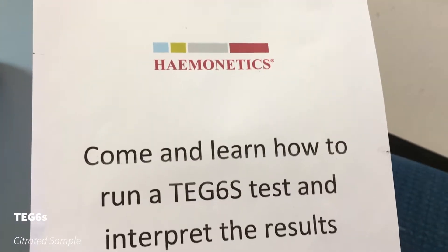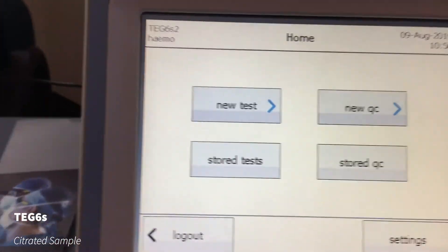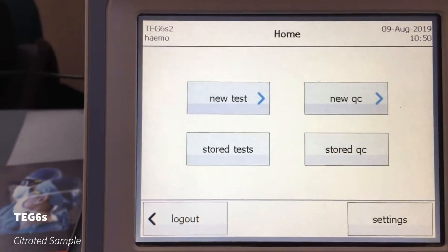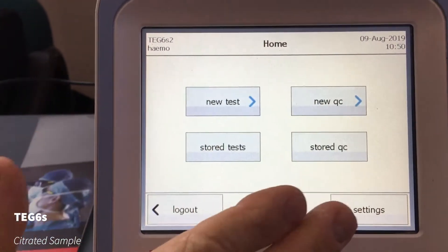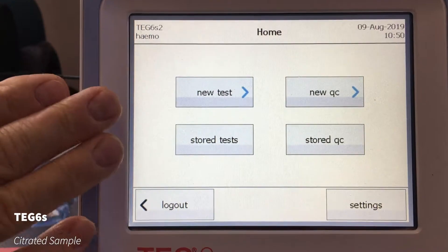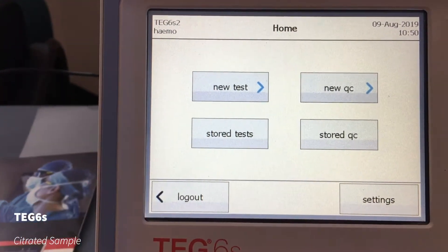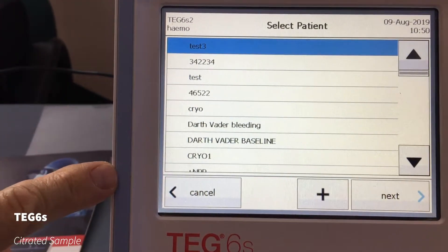I'm here with one of the Hemolinetics experts and we're going to look at this TEG machine. He's just organized it to go back. So this is the home screen once you've logged in with the TEG device. Obviously the quality control is run by your blood bank, so the new test is on the top left there. Stored test shows ones in chronological order, but we're going to a new test here.